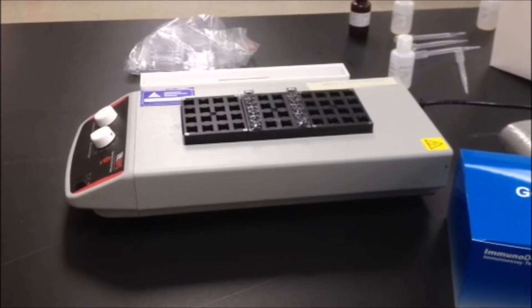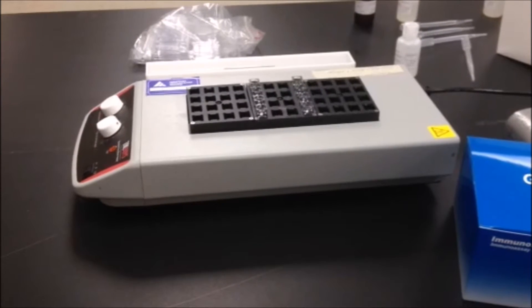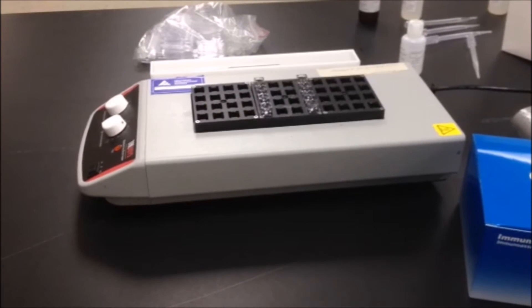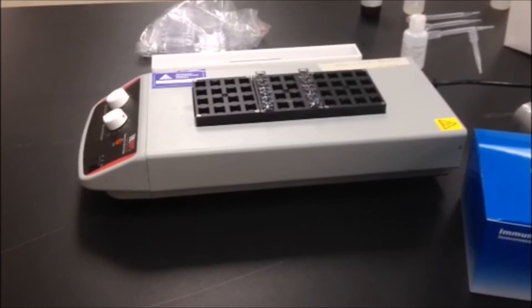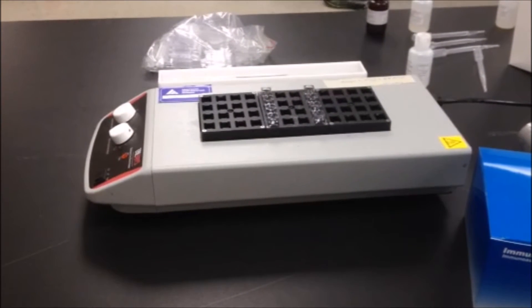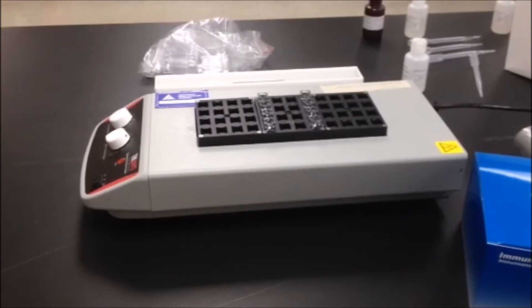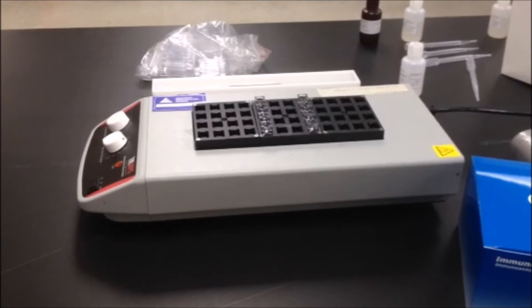Just like other immunoassays, there are washing steps between reagent steps and the wash used in the immunoassay is simply distilled or deionized water available in any laboratory. For the small workstation, you simply fill any clean container with distilled or deionized water for the washing steps.